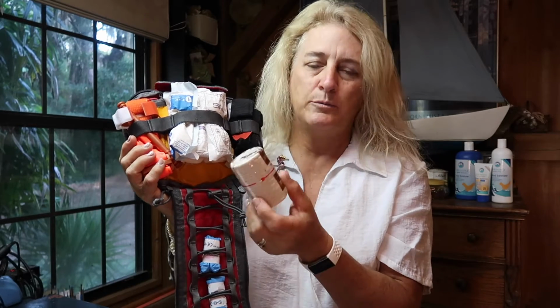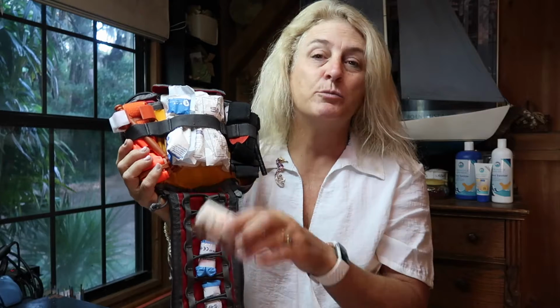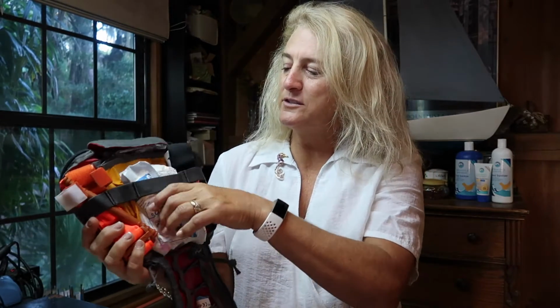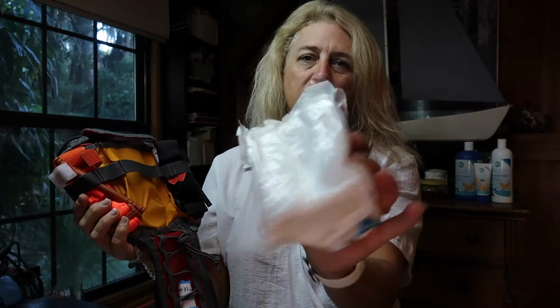This stuff is great because if somebody needs to be splinted and you need to wrap their arm, I think I'd put a magazine around their arm and wrap it, you can use this. In the middle here, this is all wound packing. There it is, lots of wound packing. You're going to stuff that wound full.